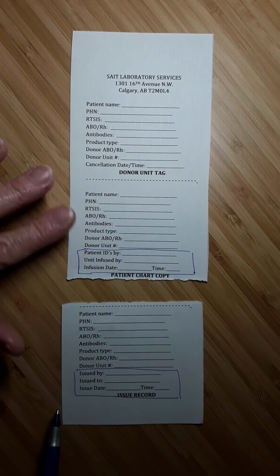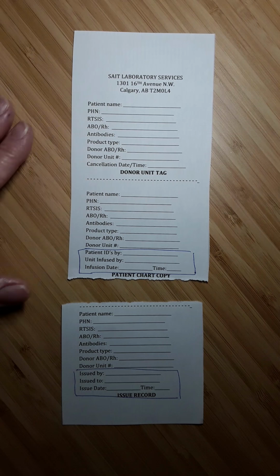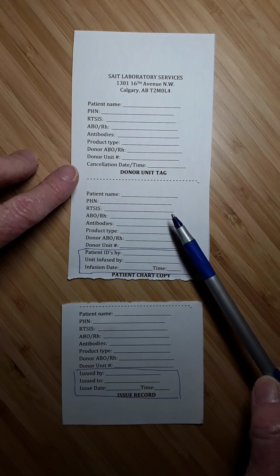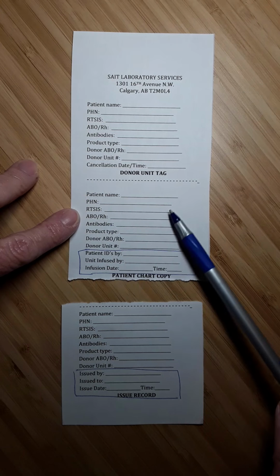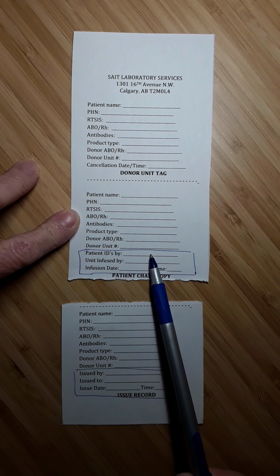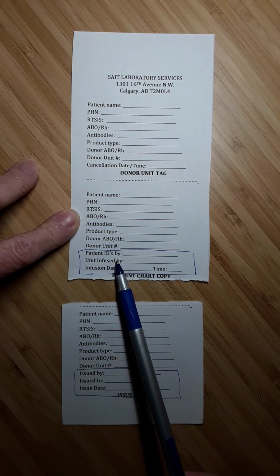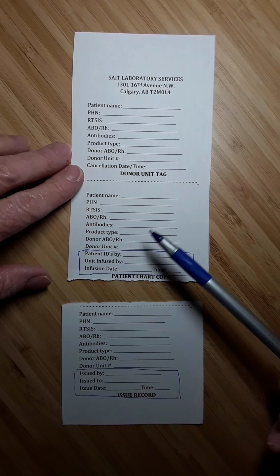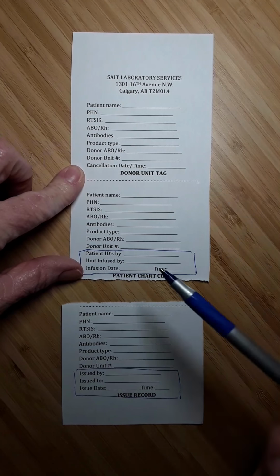Okay, and really we do not have a heck of a lot of control over what happens to this tag after that, but typically it's on the unit of blood until they get it up to the patient care unit. At that time, somebody will identify the patient, somebody will be infusing the patient, they'll put the date and time, and then they'll rip off this portion of the tag and put it where?